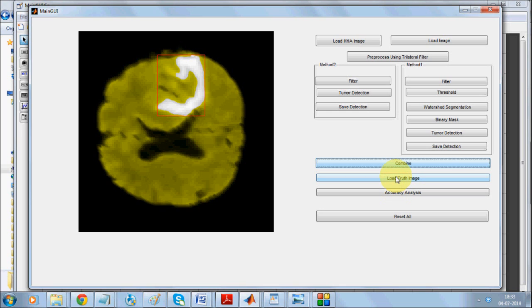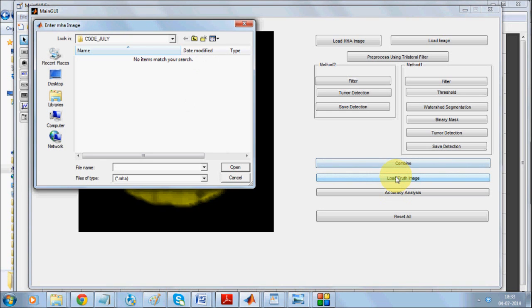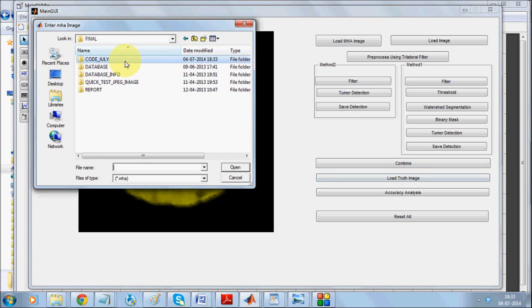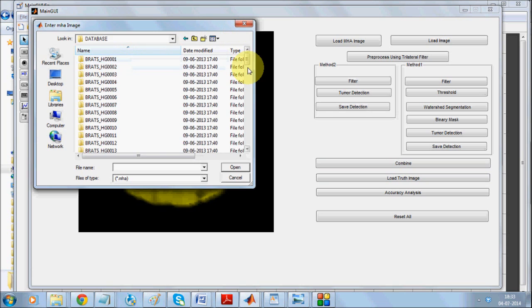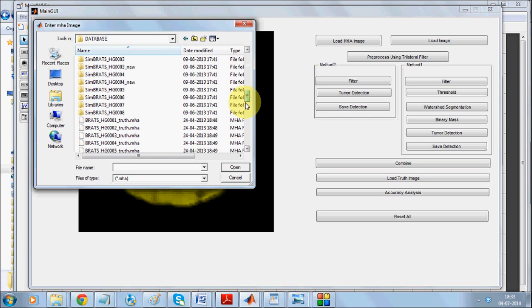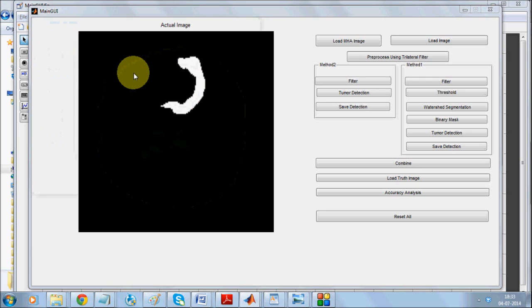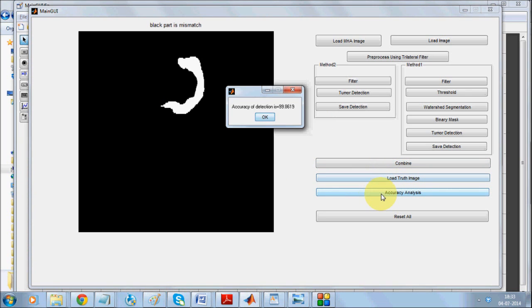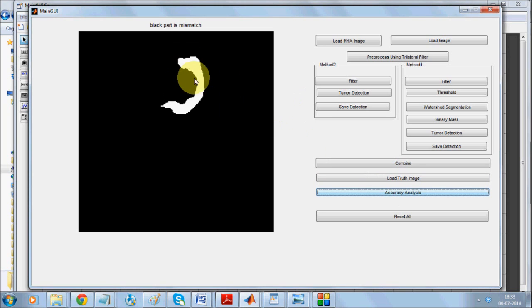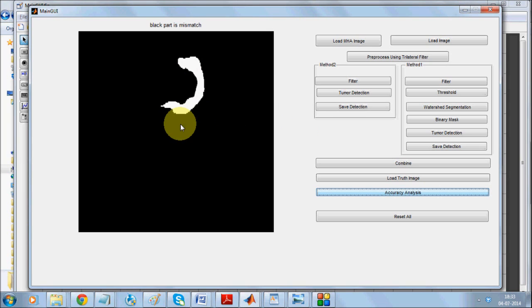Now you also have a truth image. Just load the truth image, it's present in the database. All you got to do is scroll down and here you go, the truth image. When you check for the accuracy analysis it's about 99.86%. In the accuracy we are measuring the area under the truth image as well as the area under the detected image.